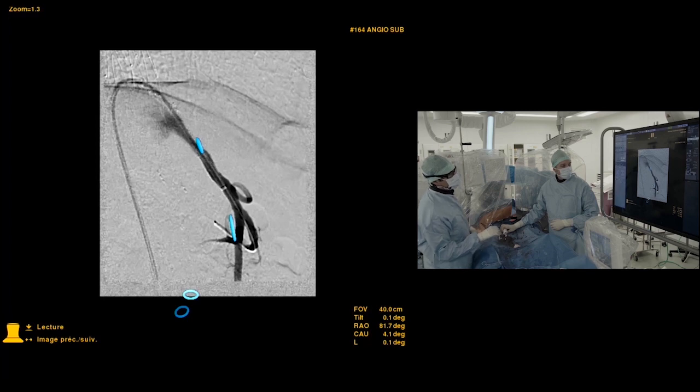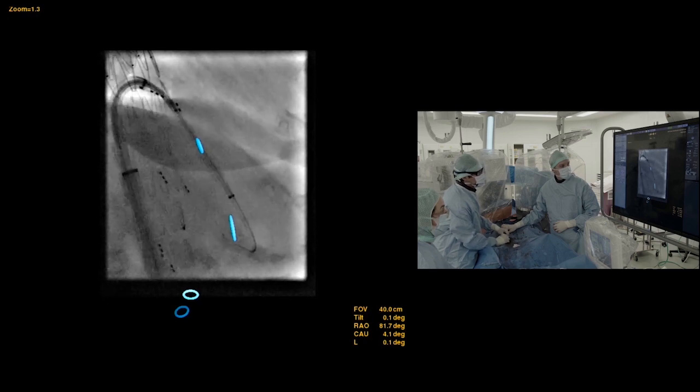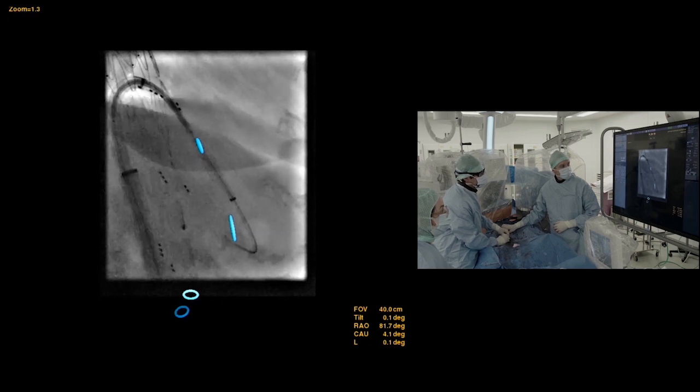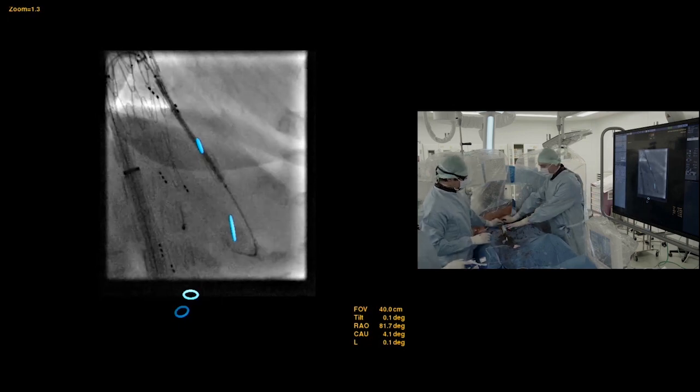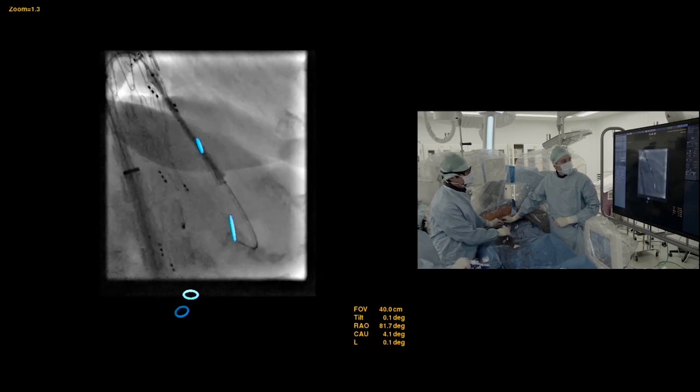So I think that if we position the bridging stent inside the previous stent, I think we're perfect. Slowly advancing the bridging stent through that kink. So Justine will, c'est bon, je vais prendre. Justine will inflate the BeGraft Plus to 10 atmospheres.